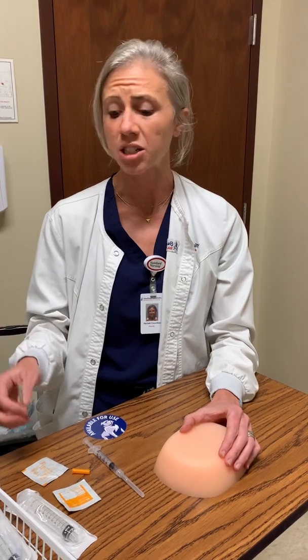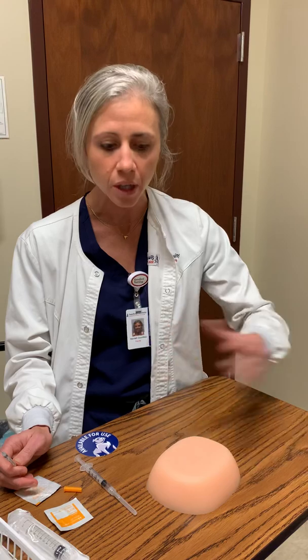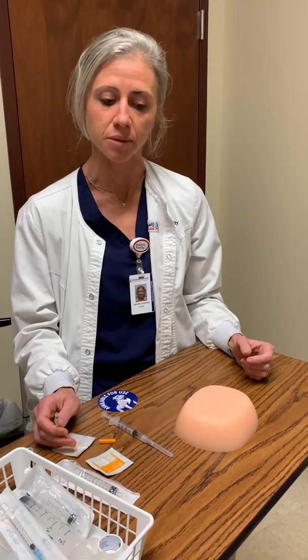But after I've released that, be mindful. A lot of times I like to even have a 2x2, which is those baby gauze, because some of your patients that are on blood thinners will even bleed, even with a subcutaneous injection. So make sure you have that prepared before you leave the site. Make sure there's no bleeding. If there is, just make sure you put a little pressure there and get that to stop before, okay? Because that could also cause a hematoma, increase some bleeding for that patient, okay?